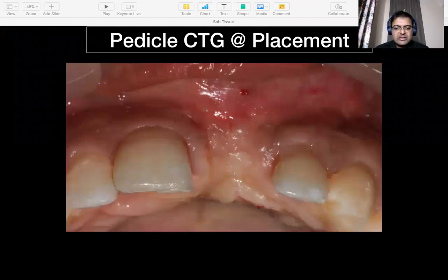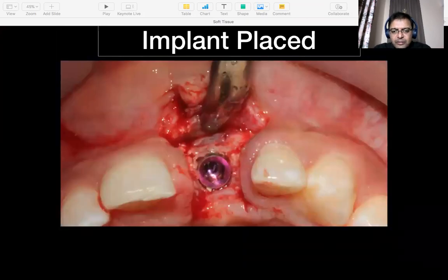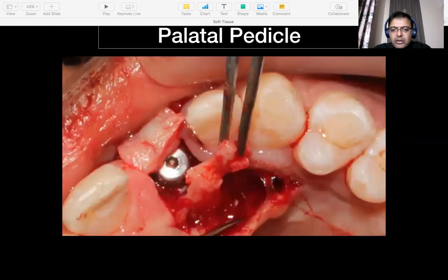Next is again a central incisor, but this time a 2-1. You again see that this site, 2-1 site, is pretty scarred with multiple surgeries that have happened there. We had a cyst there, which was cleaned up. First the cleanup was done, then we waited for 6 months, and then the implant was placed into the previously cystic site. This is at the time of implant placement. You see the implant has gone in well in the ideal 3D location: buccolingual, mesiodistal, apicocoronal.